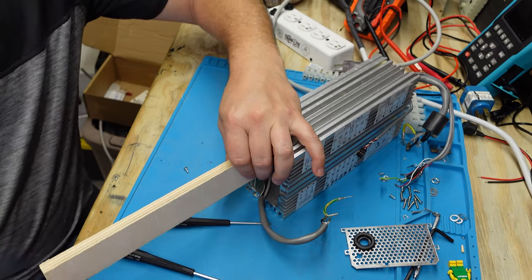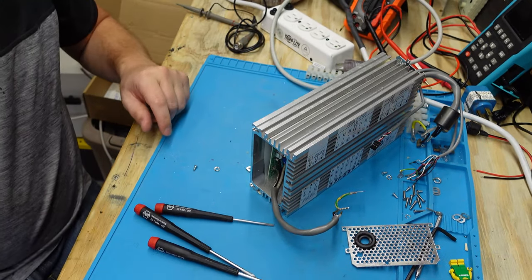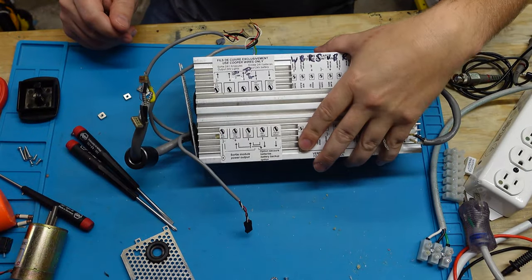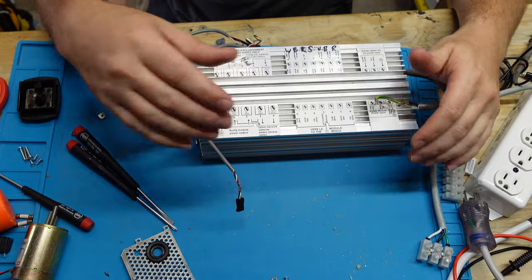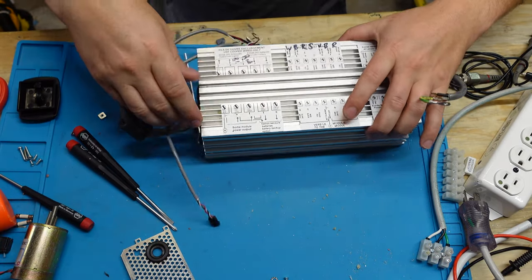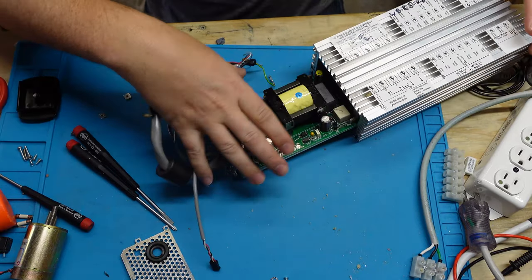Let's see if that helped. Yep, there it goes. Oh boy. Okay, cool. All right, guys. Got it switched up here so that maybe I can get you guys a better view. I've already broken it loose. Let's carefully slide it out.